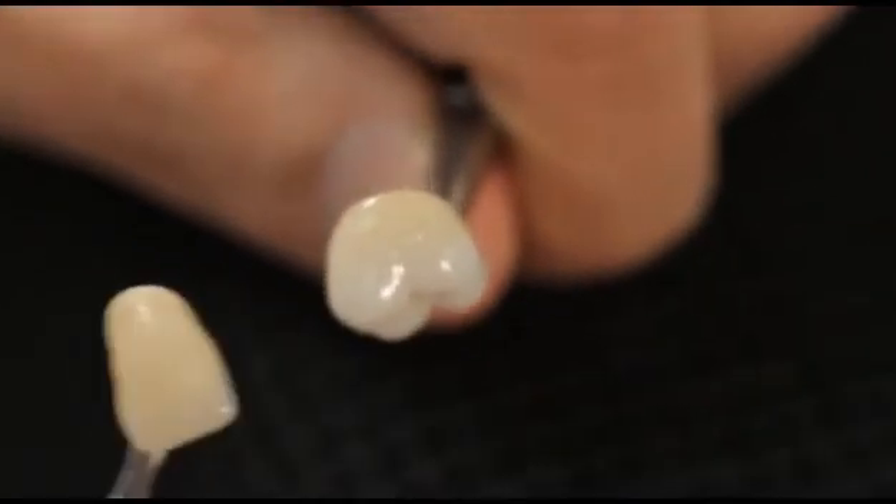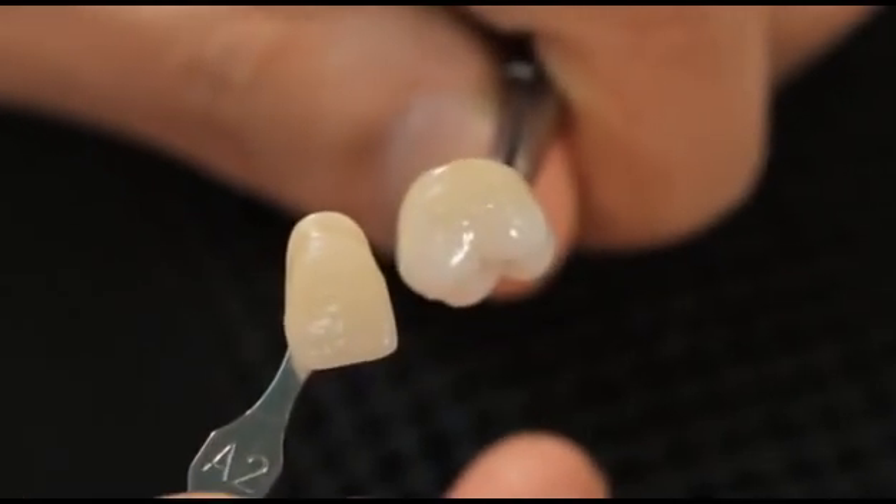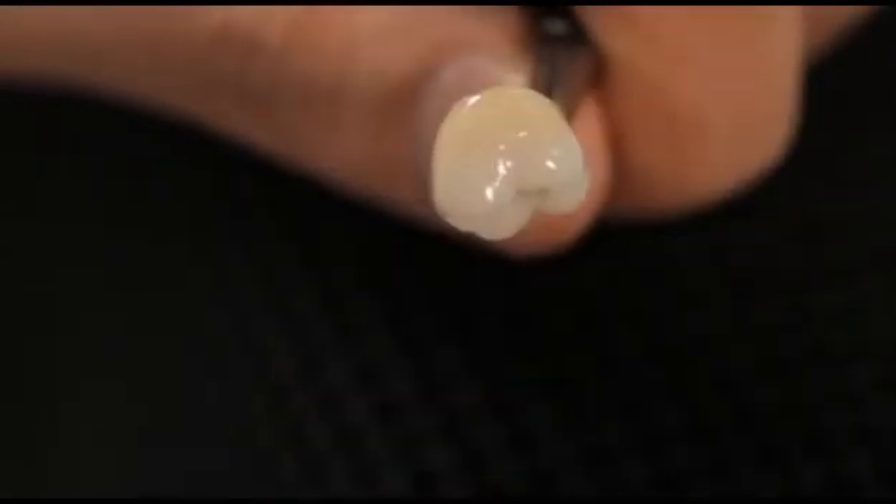These Lustre Paste NF represent a modern alternative for conventional staining and glazing, as well as for the color, brightness, gray value, and surface texture corrections of all your ceramic crowns and bridges. Due to their unique properties, it takes a matter of minutes to individualize the surfaces of your crown and bridge work — to paint on white fans, decalcifications, hairlines and crack lines, or to characterize your restorations.